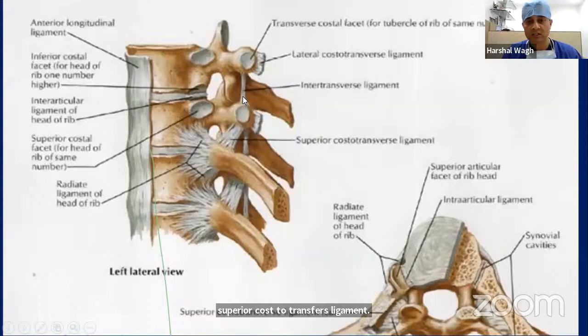That's the intertransverse ligament, which is in a lot of focus nowadays because this entire complex is now called the intertransverse tissue complex, and they're studying quite a bit about it because they are realizing there are a few gaps in these ligaments, and that might help seepage of the local anesthetic that is put around or underneath these ligaments, helping local anesthetic reach the paravertebral space.